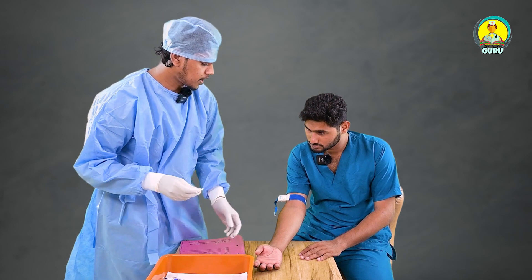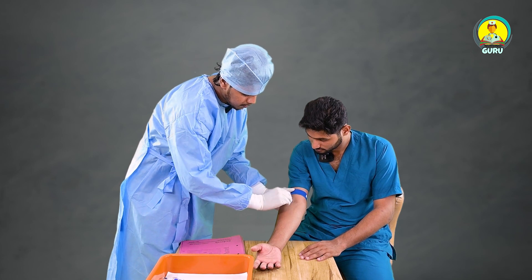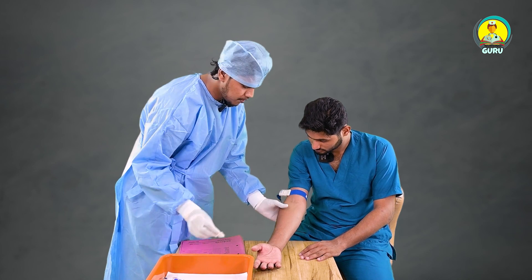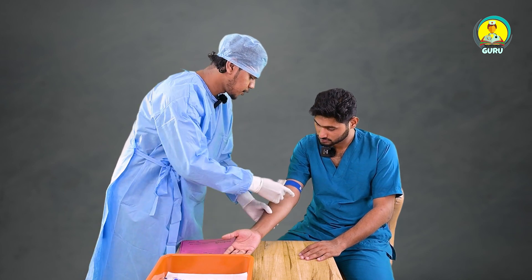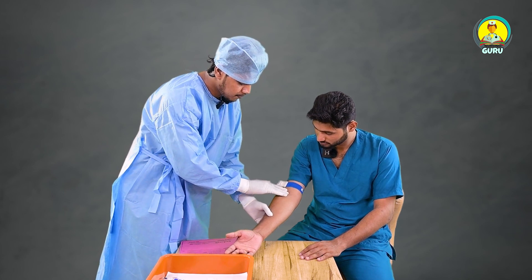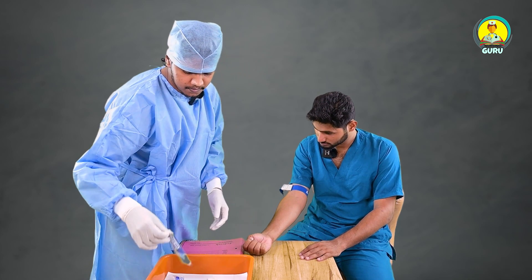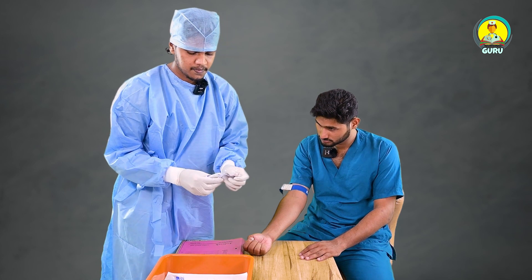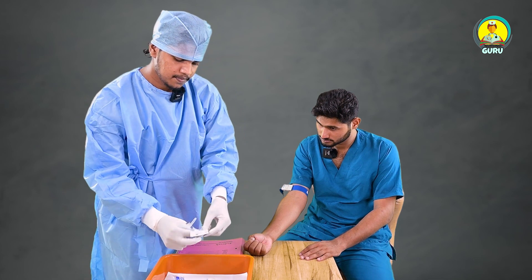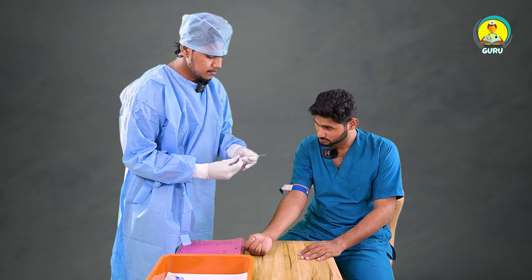We have to apply the tourniquet and we have to clean with alcohol swab. And we need to wipe it away. Hold your hands. We need to take the syringe.